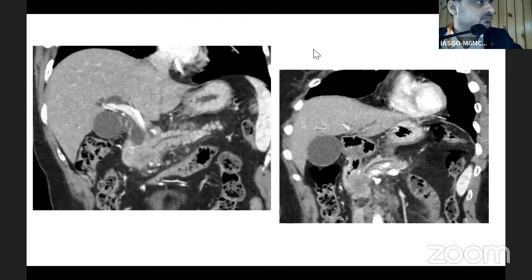It's not very common in choledochal cysts. Another important radiological feature would be the stone and obstructive jaundice, by and large, unless it is type 5 or beyond. Choledochal cysts, which are very rare, have secondary biliary damage, which appears to be a little different from the type 4 choledochal cysts.